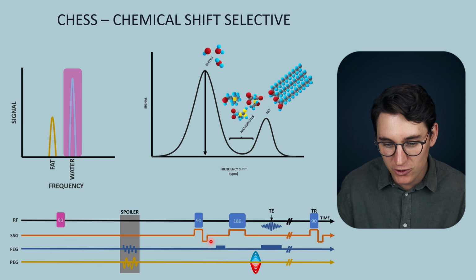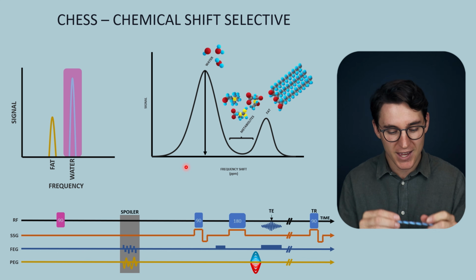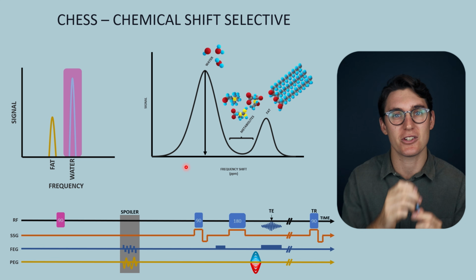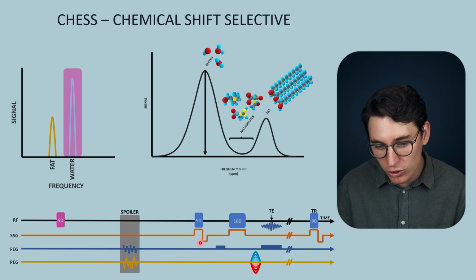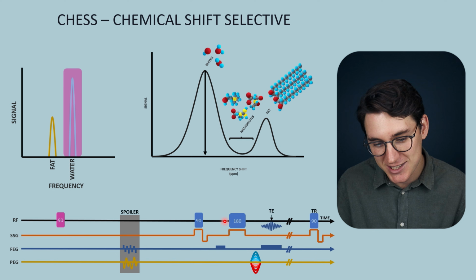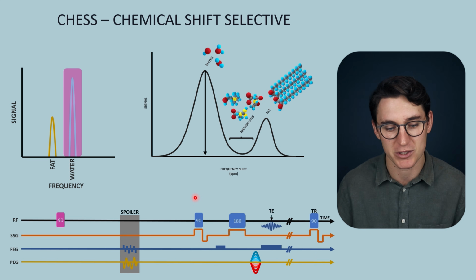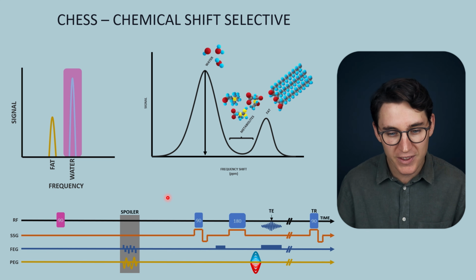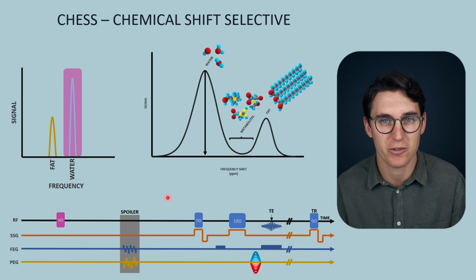We can then run a normal pulse sequence with our initial 90-degree RF pulse. There is no longitudinal magnetization vector in water to be flipped into the transverse plane. Only other tissues, fat and metabolites, will contribute to signal for this pulse sequence here. Here I've represented a spin echo pulse sequence. We're going to look at a specific MRS pulse sequence that will occur after this spoiler gradient has occurred. This will allow us to select specifically water to suppress signal coming from it.